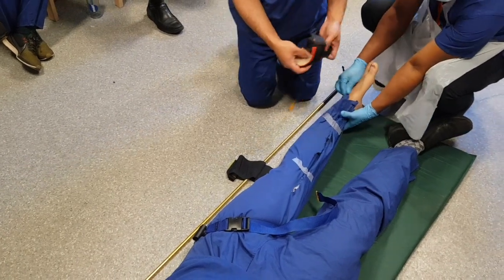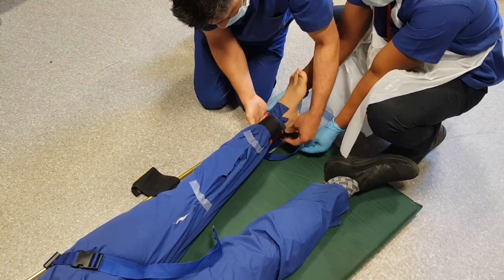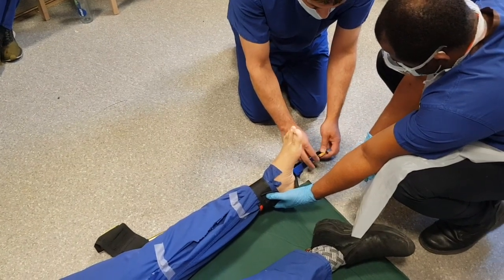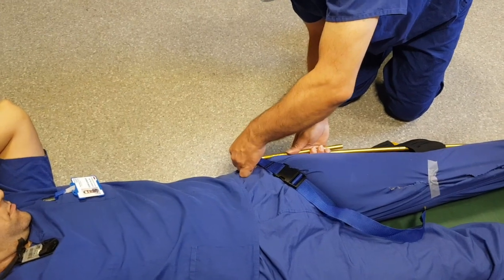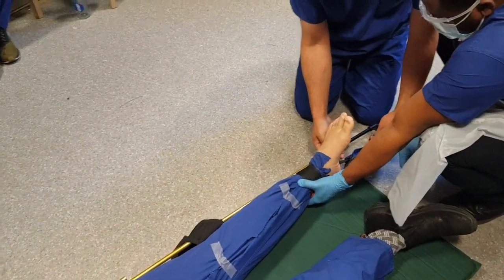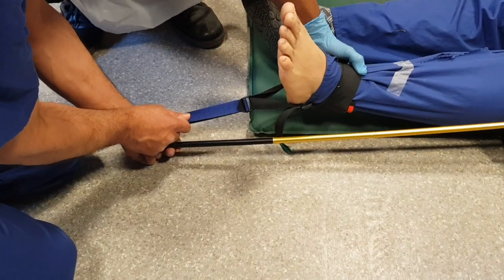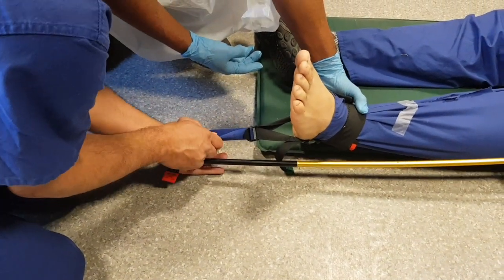I'm going to put this ankle strap on. That provides us with a hoop underneath, and the yellow hook is going to attach to the tent pole at the bottom. At the top end, I need to pull that in and apply it into the plastic retaining device. At the bottom, I've got this green strap which you can use to tighten this up. And then if I want to apply traction, I'm going to pull on the red strap — and that's generating traction by pushing into the groin and pulling down onto the leg.